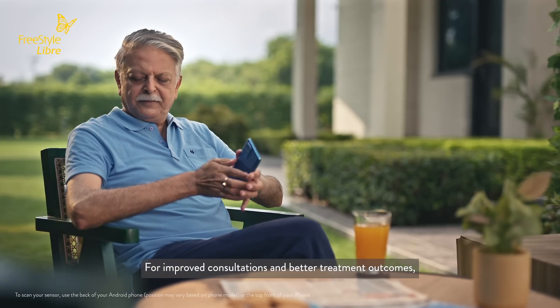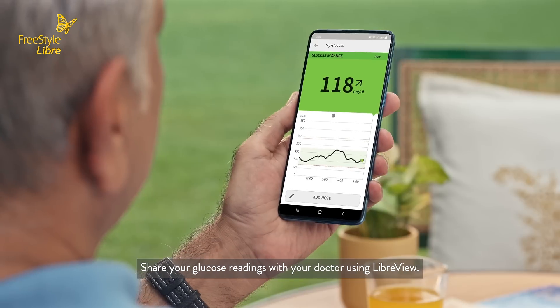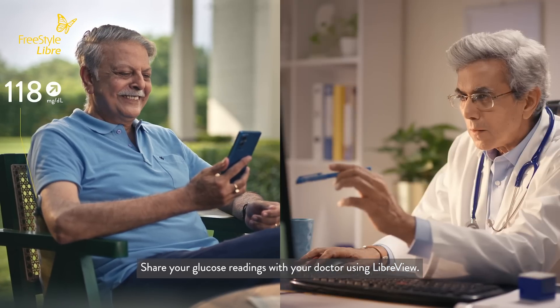For improved consultations and better treatment outcomes, share your glucose readings with your doctor using LibreView.